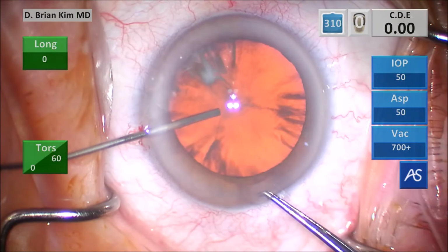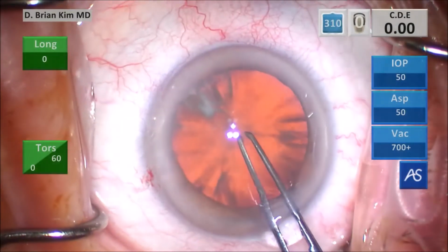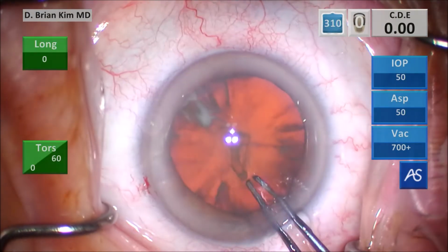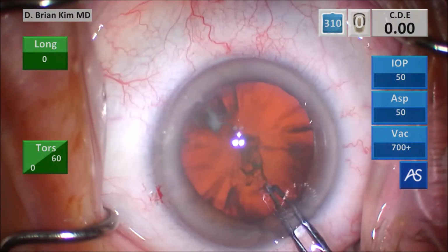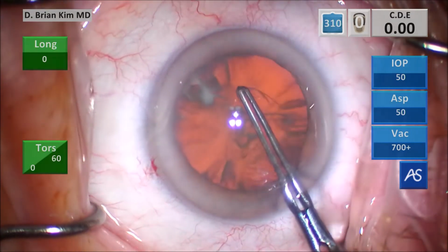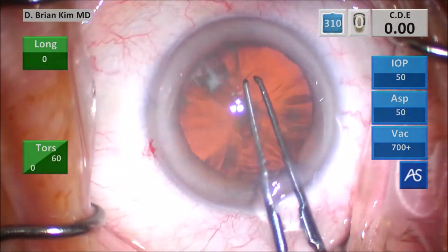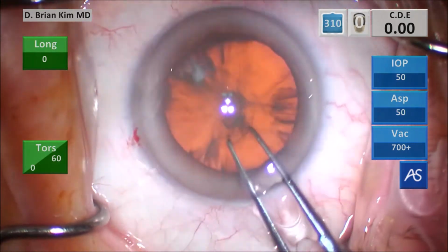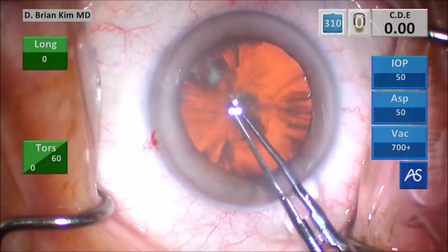Go in with the teeth sideways for my puncture style rhexis. Go ahead and puncture. Pull towards me. I'm able to get a nice tear there, grabbing the right side of the tear, making sure I'm controlling it so that it's the appropriate radius so I can start the rhexis. I go around, grabbing and re-grabbing, pulling the flap, trying to stay within the corneal mark, which will hopefully help me center and size the rhexis.